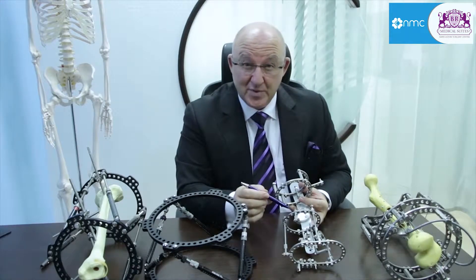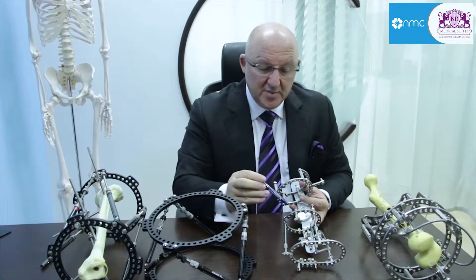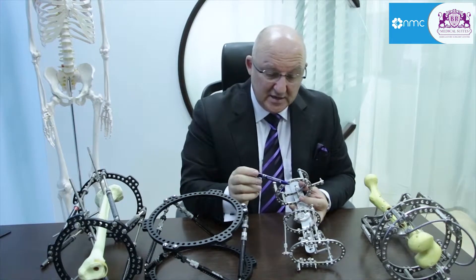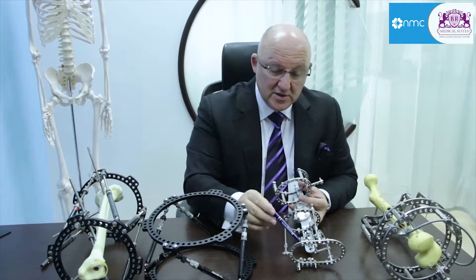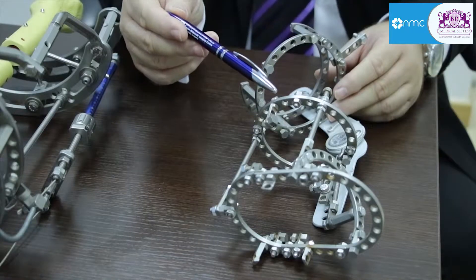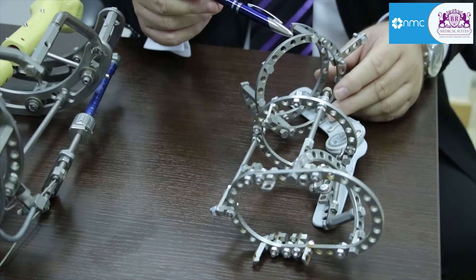In the first step of this treatment, we have to stabilize these malformed limbs in a mini ring fixator. Here you can see this shoe-like formation — here's the foot fixed in. This part is for the lower leg, and this is for the thigh.